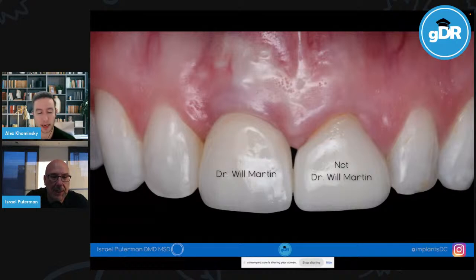Meaning, as opposed to a titanium sleeve, a 2.2 or 2.8 sleeve. That really depends on the tooth size and how much interproximal space there is. A lot of the lower central incisors have to be the 2.2 sleeve, and they're not fully guided.